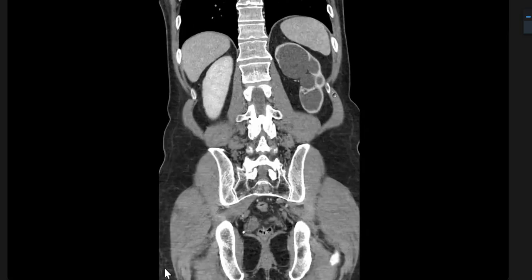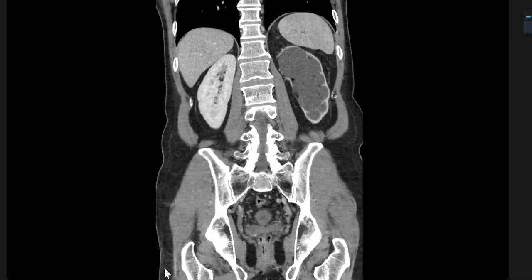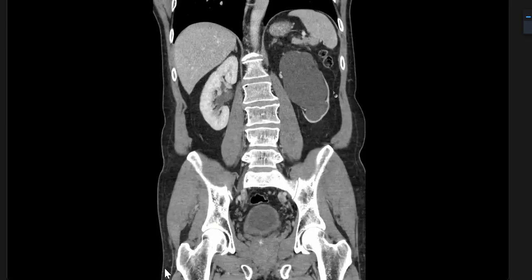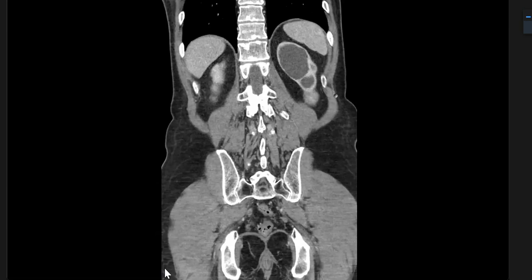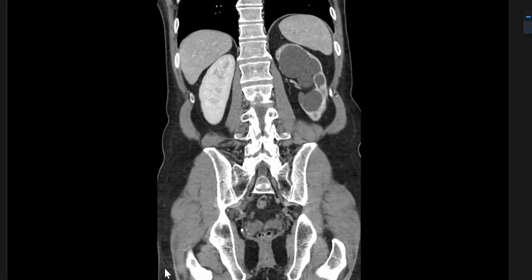In ultrasound, we can differentiate the cyst from hydronephrosis. Is it easy to differentiate a simple cyst from a large hydronephrosis on ultrasound? We can have an idea, and second, if the patient's renal function is not normal or is deteriorating, we can do a nuclear scan to assess renal function.